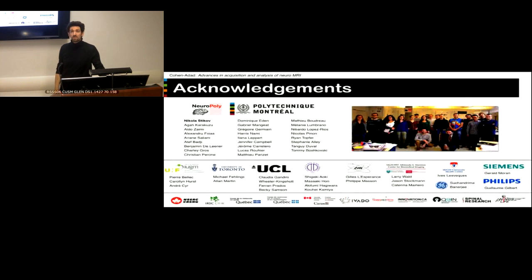Basically, there are some similar patterns across people. Every person breathes in a different manner. Some more with the chest, some more with the belly. So there are probably things that we can learn from it. But currently we don't try to learn. We just map, we record the points we need, and then we just map them in our fitting algorithms. Okay. So you do the training at the beginning of every scan then? Yeah. Exactly.